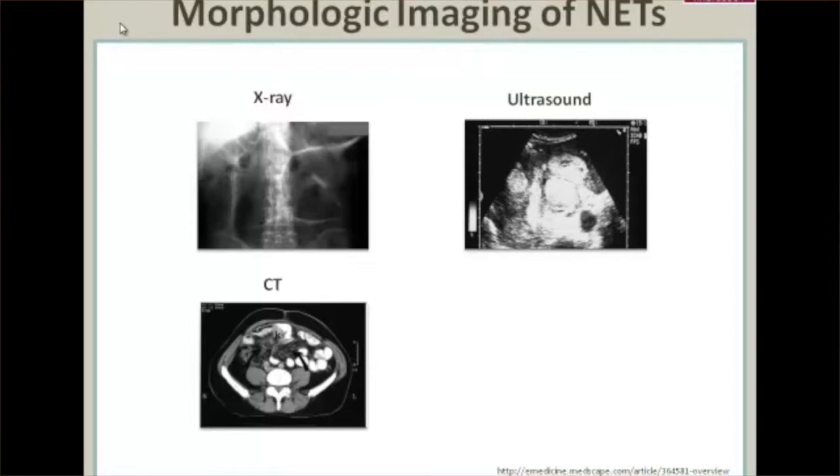The difference between a CT and an X-ray that people often ask about is that an X-ray is basically a two-dimensional image. You stand there, they shoot it, that's it. A CT is done with spiral slicing. Think about how a spiral sliced ham is, stay with me, this is kind of a weird analogy. A ham is spirally sliced and you have those thin slices that can be put together, but if you peel it apart, you can see that's exactly what a CT does. It spirals through a person's body and gets thin slices so we can see what's going on in each slice.